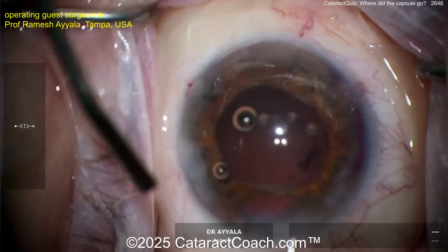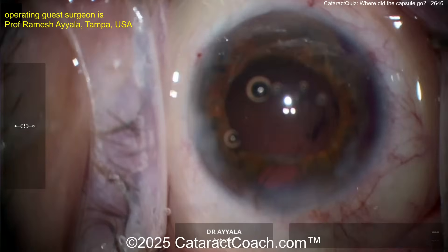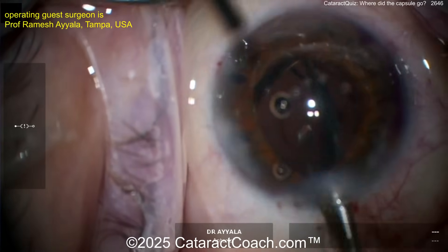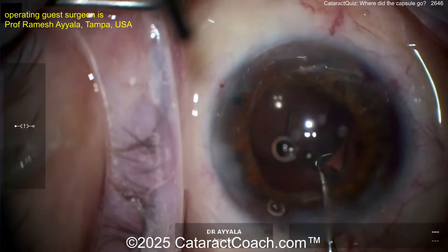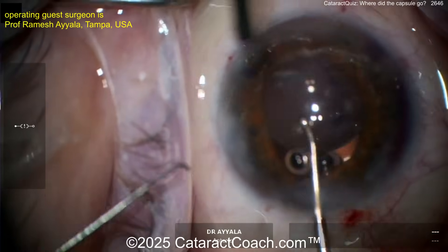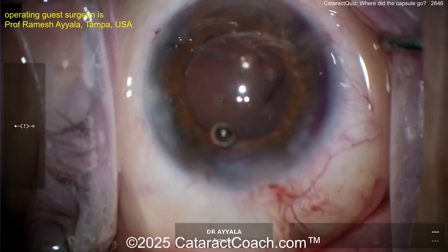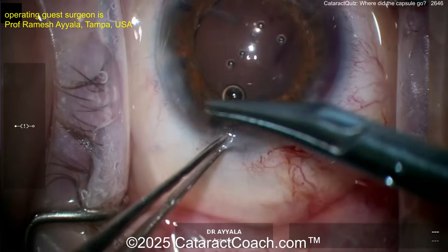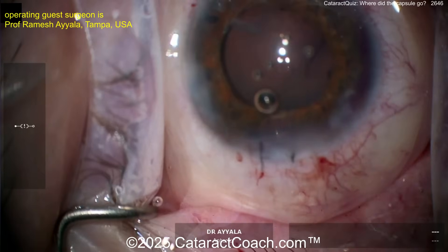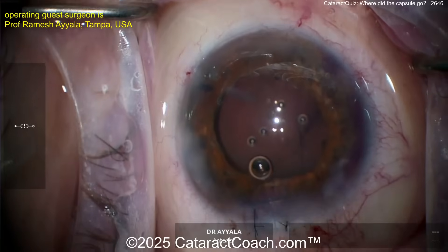Where did the rhexis go? It could be a really loose bag — as you took the cataract out, that stretched bag kind of pushed up under the iris. Now here comes the lens — 40 diopter. 40 diopters is the highest power we can get here in the USA. If your patient calcs out to a 45 diopter, just put in the 40 and call it good — the patient will be quite happy. A single-piece acrylic lens, power 40.0 diopters. Suturing these incisions is a great idea. Wow, what a tough case!